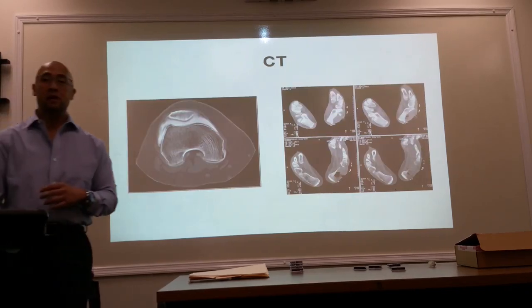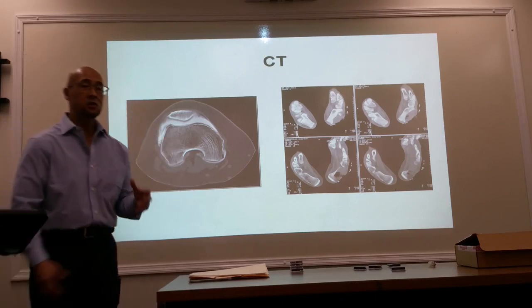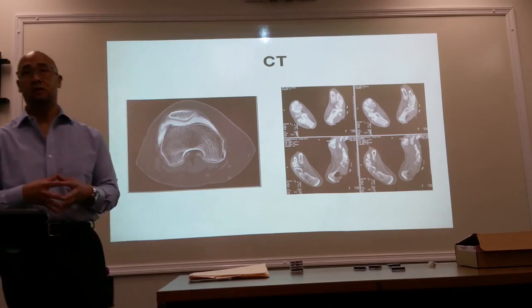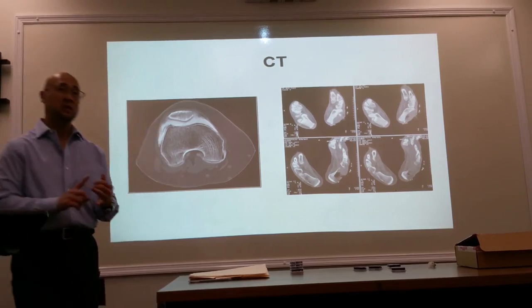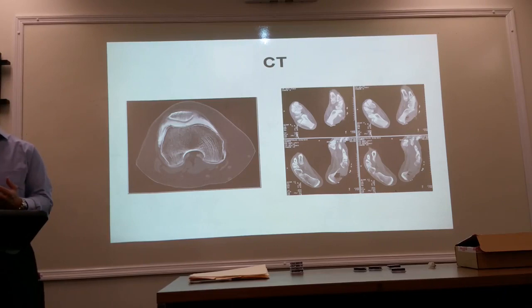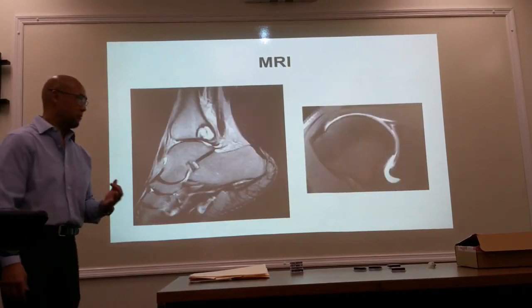CT is the most common way of evaluating joint spaces now, because x-rays are good for bones, not good for joints. So if we're evaluating the joint, it may be done either by CT or what's the other modality? MRI.